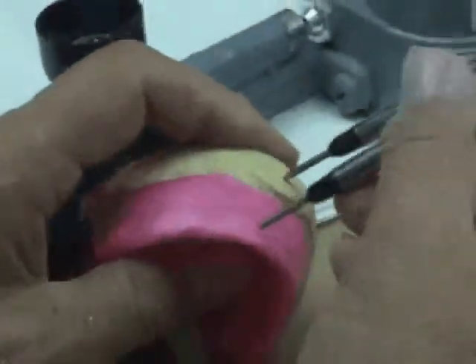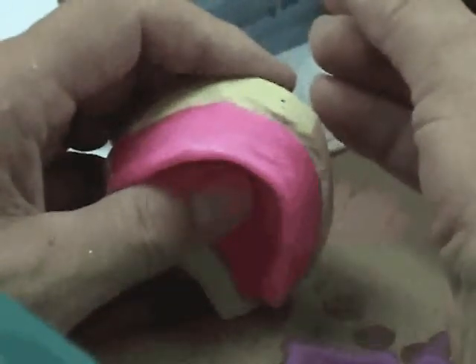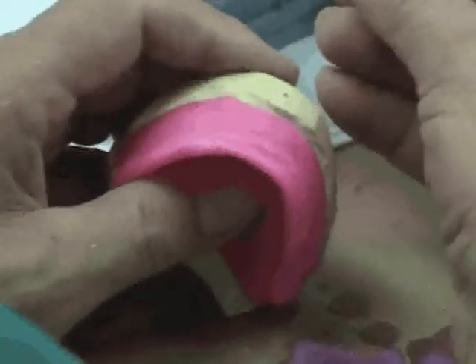So now we're going to put the aesthetic control base back on the model, and then we're going to measure the lower lip line onto the aesthetic control base, and we just scribe it onto the wax like that. And then we warm up the rim former again, and we're going to melt down to that point.